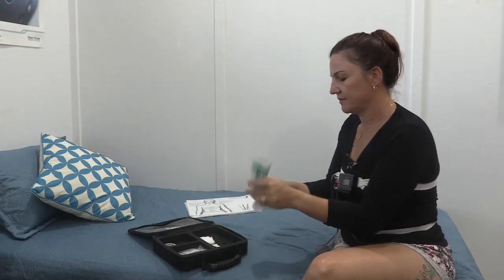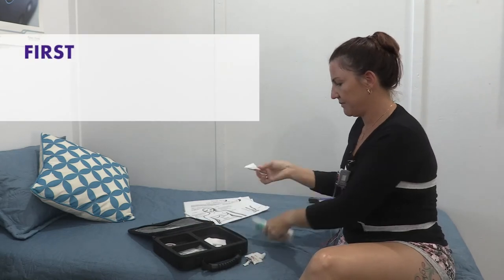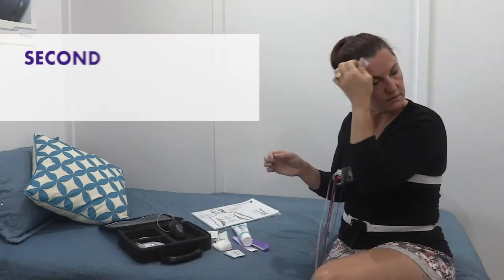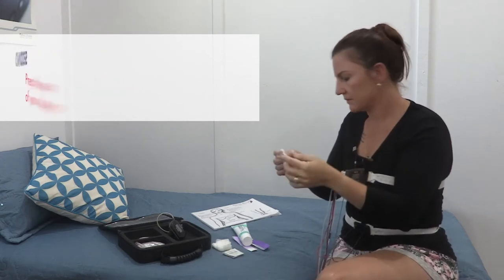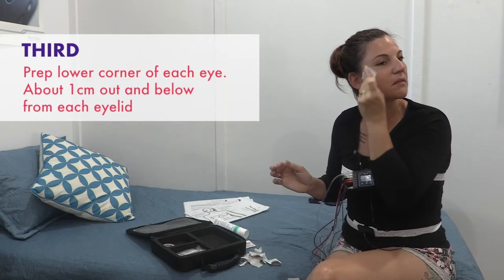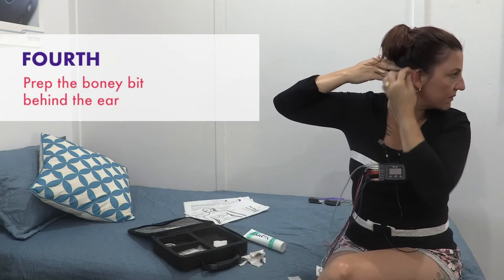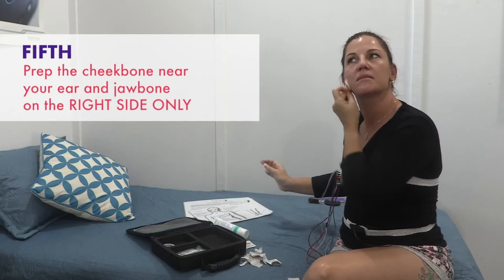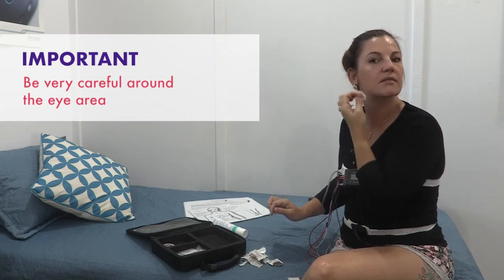Put some NuPrep onto a gauze swab and rub your skin thoroughly, then follow with an alcohol wipe and let dry. First, prep your widow's peaks, or outer forehead near your hairline, on both sides. Second, prep the centre of your forehead. Third, prep on the lower corner of each eye, about one centimetre out from and below the eyelid. Fourth, prep the bony bit behind each ear. Fifth, prep the cheekbone near your ear and jawbone, on the right side only. Important: be very careful around the eye area.